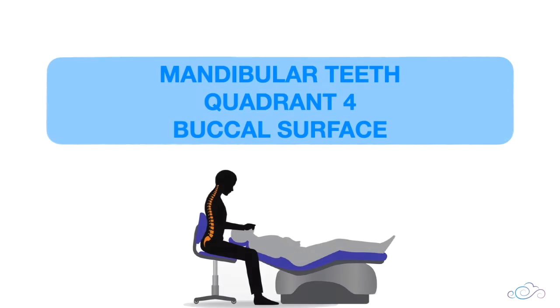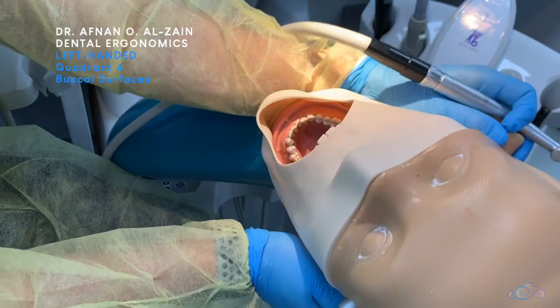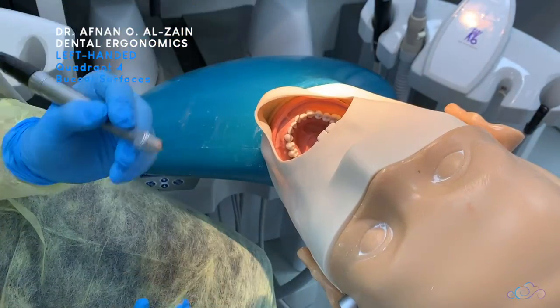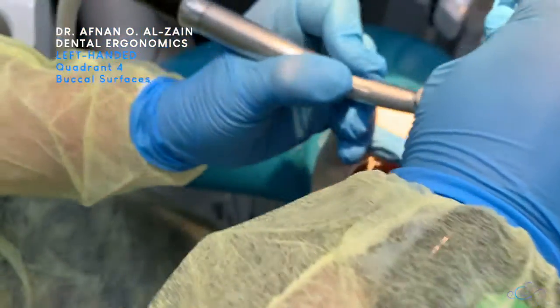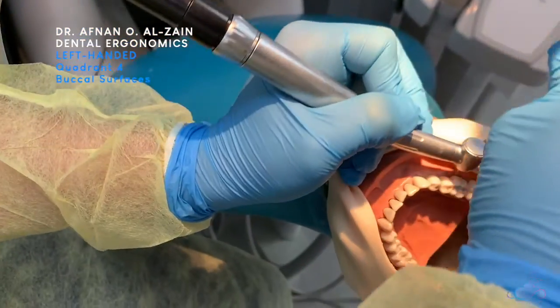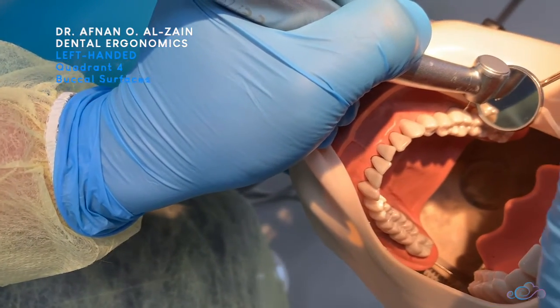Moving on to the buccal surfaces of quadrant four. When working on these surfaces, you can tilt the dummy head position more towards the left so you can see the buccal surfaces clearly. Then you're going to place the burr perpendicular to the surface with finger support, and use the mirror to reflect the light or retract the cheek.